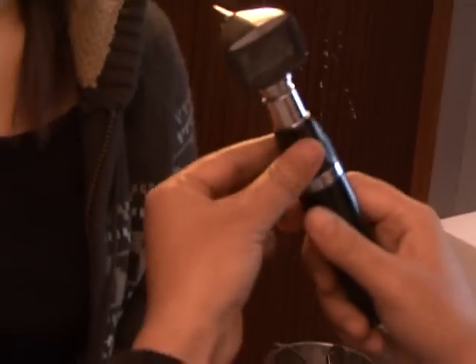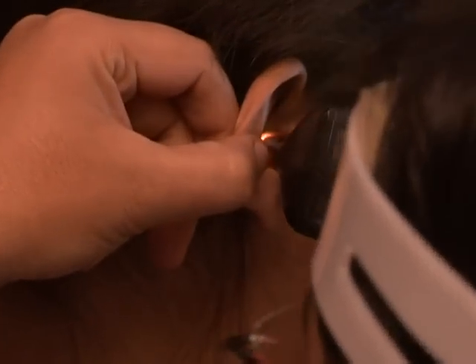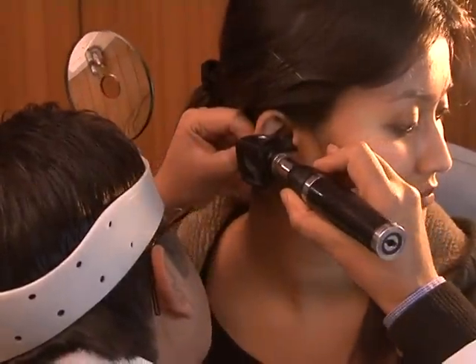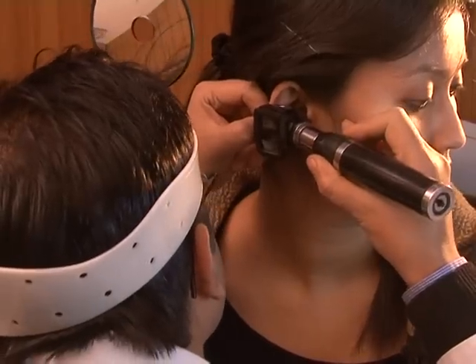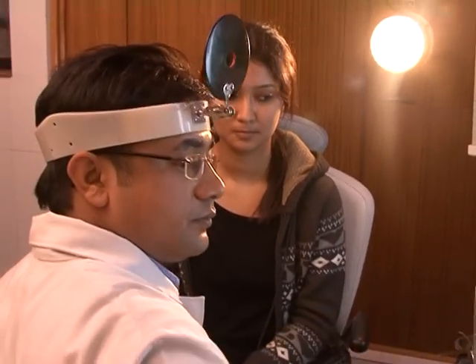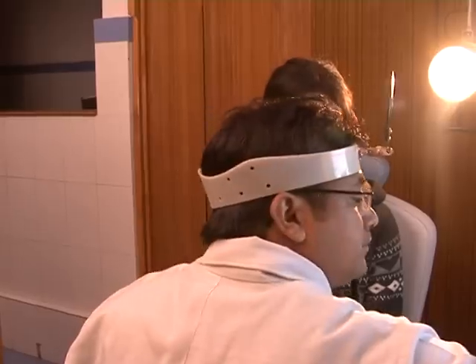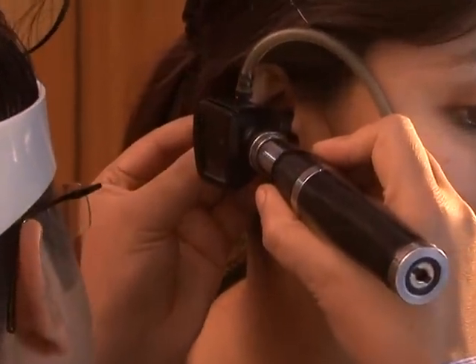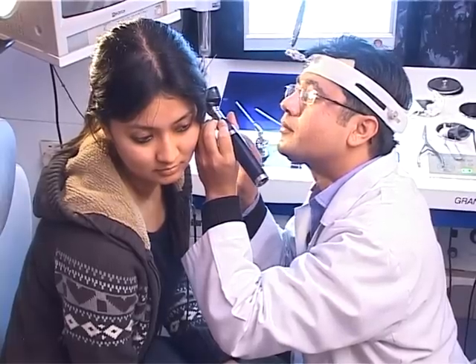An otoscope with good illumination is used to examine the tympanic membrane. The otoscope is held in the right hand for the right ear and left hand for the left ear in a pen-holding fashion, with the little finger kept as a fulcrum on the patient's cheek. We observe the position and colour of the tympanic membrane, ossicles through the membrane or through the perforation if present. Mobility is assessed using a Siegle's speculum, and the middle ear can also be examined through the perforation.